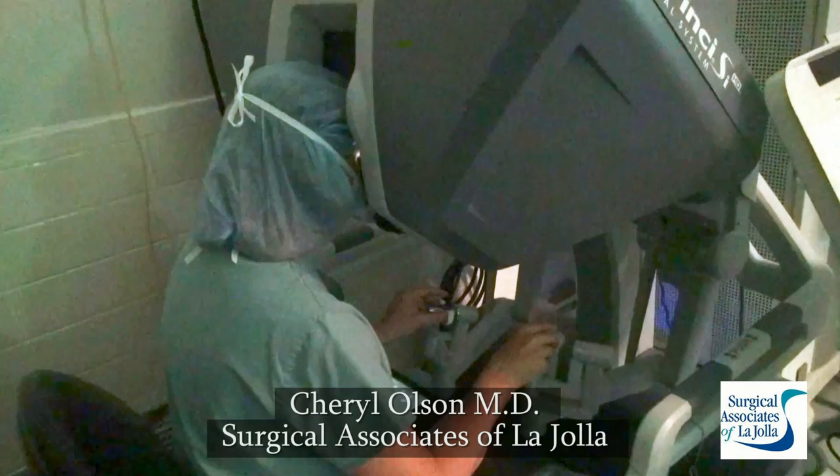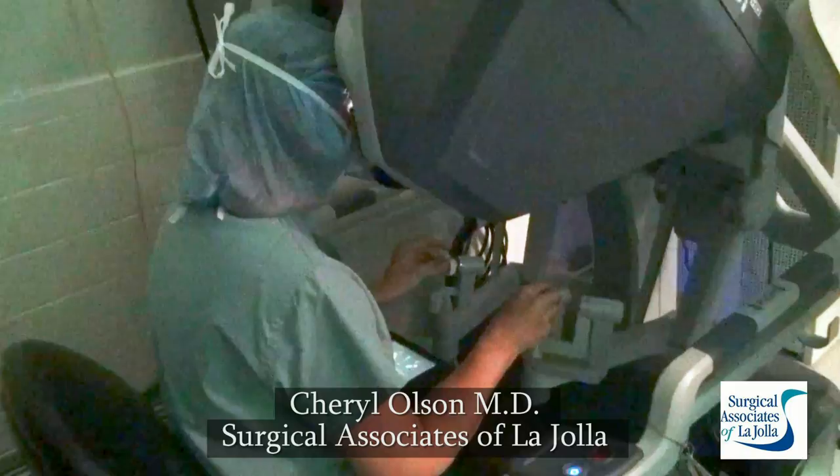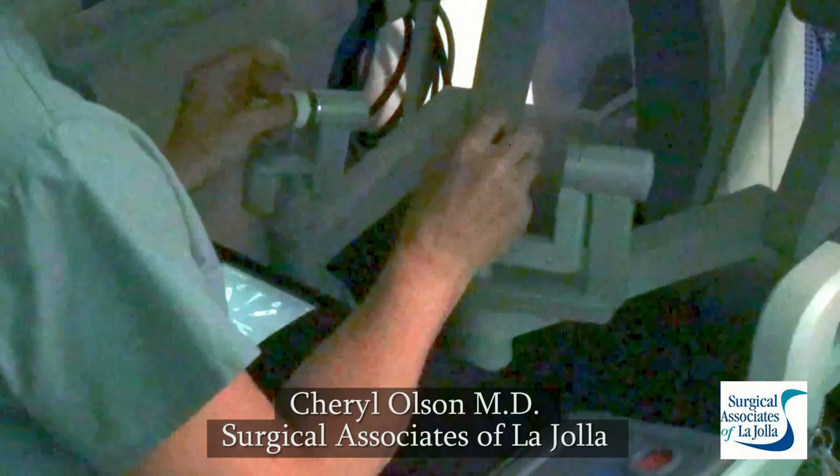Once the instruments are in, I go to the console where I control the instruments that have been inserted. The critical thing here is that my right hand controls the instrument, but the instrument actually originates from the left, so the robot crosses my hands.